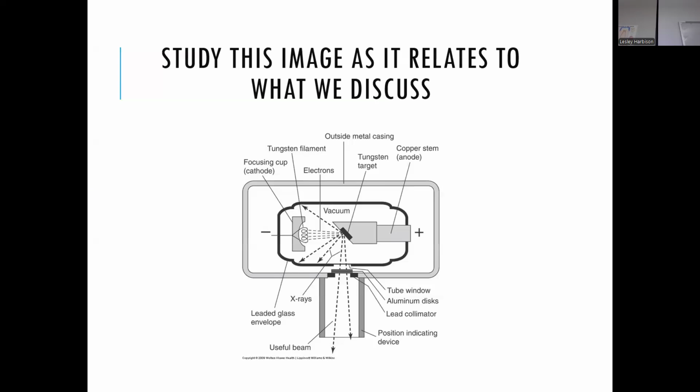On the other side, I won't talk too much about the process, I just want you to visualize the pieces because we're going to get into the process in a second. On the other side, where the blue piece is, at the top, write anode, and that is the positive side. The big blue metal thing is made of copper.